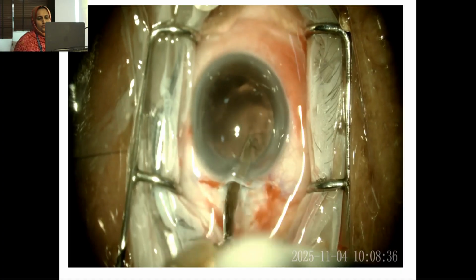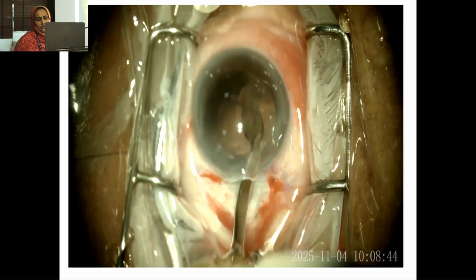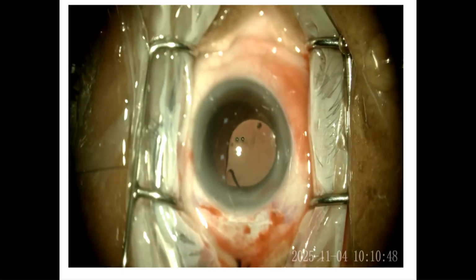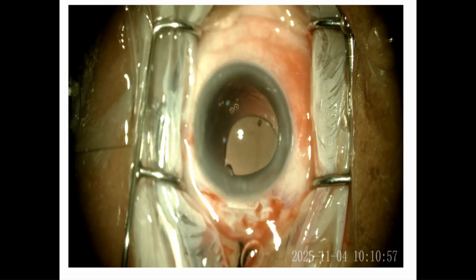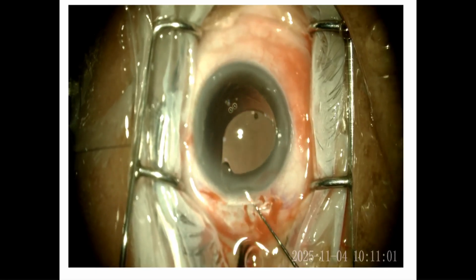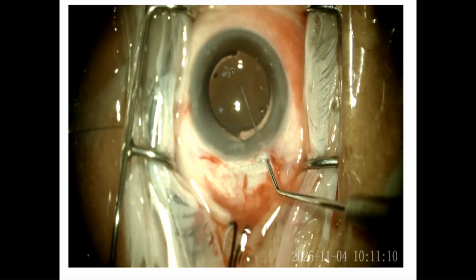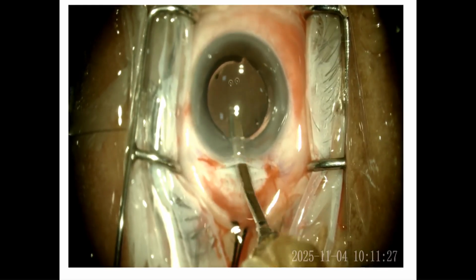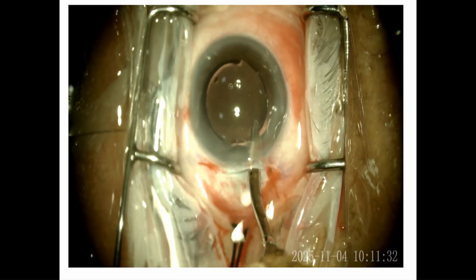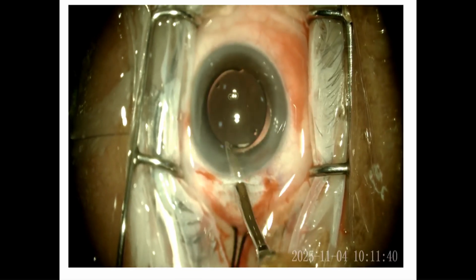And when you're going through the main port, make sure to lift the anterior lip. And then again inject visco. The bag should be well inflated with visco. Then you take the Sinskey and push the haptic through the optic, and then drag, depress and dial in a clockwise direction. And then do a thorough cortex visco wash and tap gently on the IOL to remove the visco from below and also through the angles, all of that.